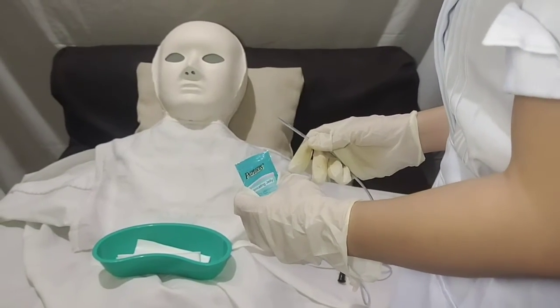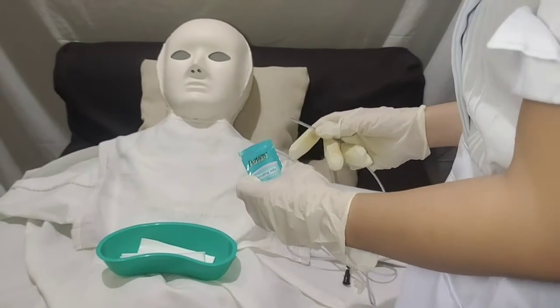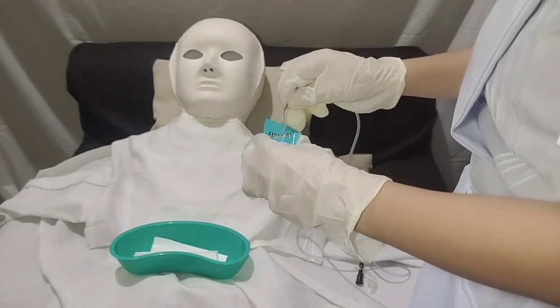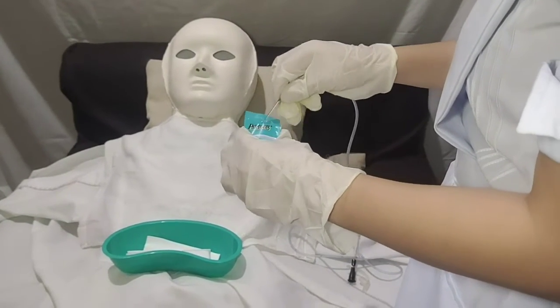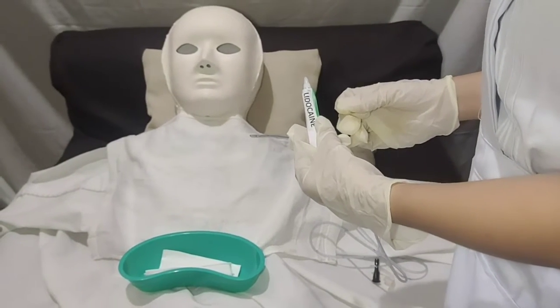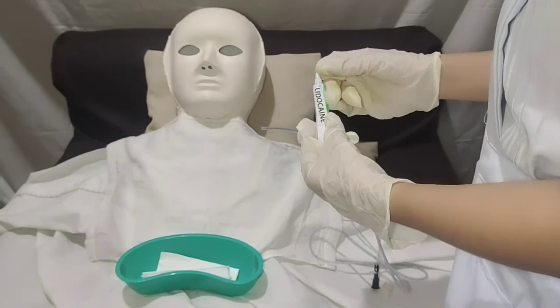Next is to lubricate the tube tip at least 2 to 4 inches with water-soluble lubricant. After that is to apply topical anesthetic to the nostril and oropharynx as appropriate.